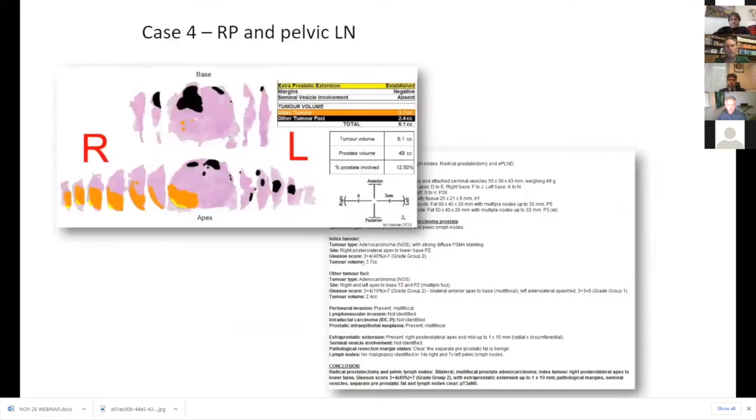These were graded as 3+4 on that right. So a little bit of a downgrade from the 4+3, 60%. And interesting that 4+4 I think you got in the right anterior. I think that's a spurious result because I think it was 0.3 or 0.4 millimetres. So we've obviously just touched something and only sampled the 4 part of this. And then smaller, lower grade 3+4 and 3+3 in those other more anterior zones.